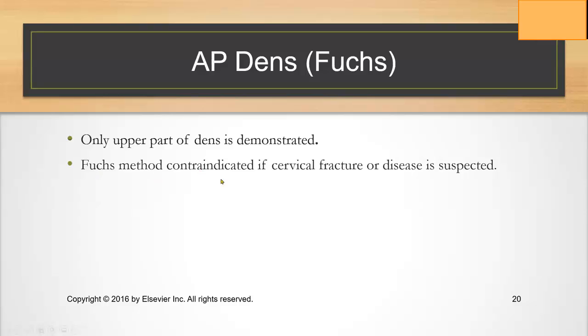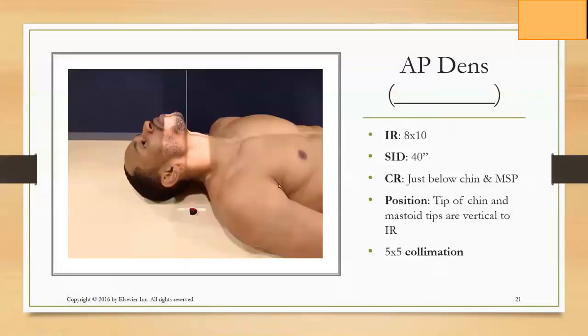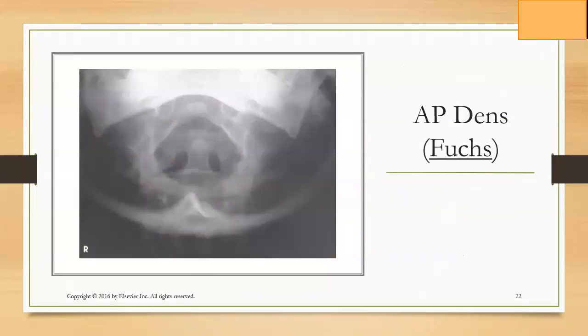Now do note, Fuchs method is contraindicated if there is a cervical fracture or some type of disease that might be going on, so you don't want to hyperextend their chin up. So for an AP Fuchs, 8 by 10, I believe it is 40 inches, we would have the patient extend their chin up as high as possible, perpendicular beam coming down directly just inferior to the mental point of the mandible. So position, tip of chin and mastoid tip are vertical to the IR, collimate to about a 5 by 5, suspend the respiration, and what you should see is the dens process within the foramen magnum.